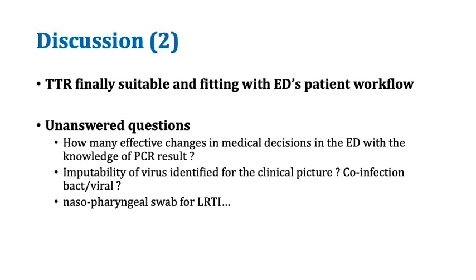Concerning the time to result, it was finally suitable for the ED patient workflow. However, there are unanswered questions, of course. We don't know yet how many effective changes in medical decision in the ED were made based on knowledge of the PCR results.